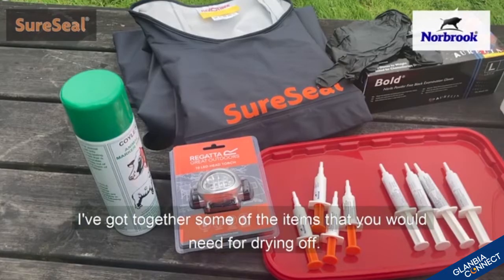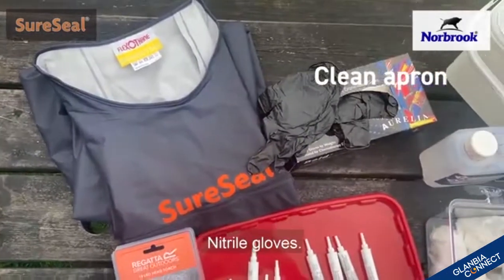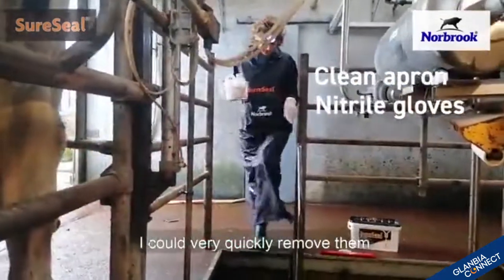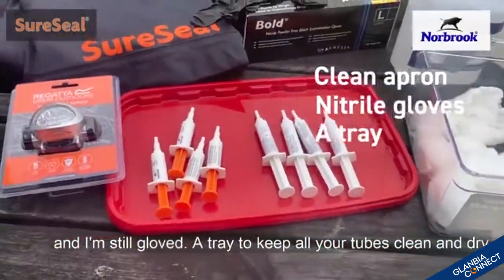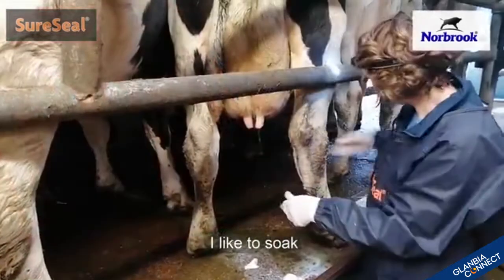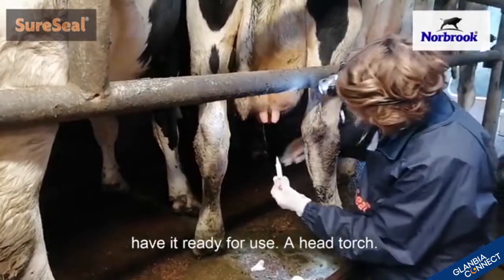I've got together some of the items that you will need for drying off. So firstly, a clean apron, some nitrile gloves. I actually like to double or triple glove, so if my first pair of gloves get contaminated I can very quickly remove them and I'm still gloved. A tray to keep all your tubes clean and dry before use. Lots of cotton wool soaked in surgical or methylated spirits — I like to soak it all in a tub, have it ready for use.